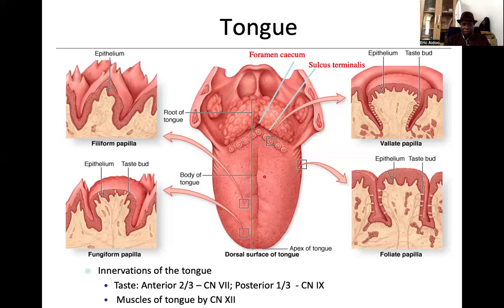And you have different types of them. So you can have this one at the anterior portion of the tongue. You have the fungiform papillae, okay? The name is given in relation to fungi, a type of fungi, the mushroom, the way it looks, okay? So fungiform papillae. You have the taste bud within it. Then you can also have this one, which is a little dorsal, let me say posterior to the fungiform, and a little medial also, is the filiform, okay, which has pointed edges at the tip.